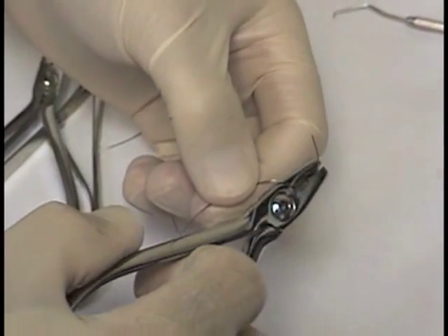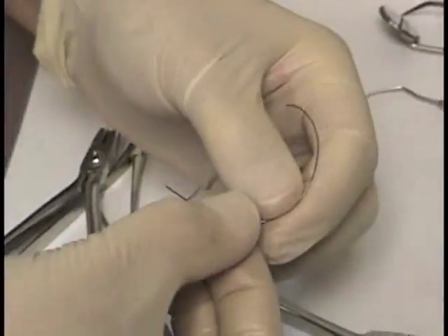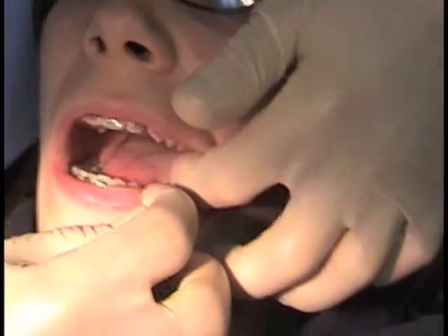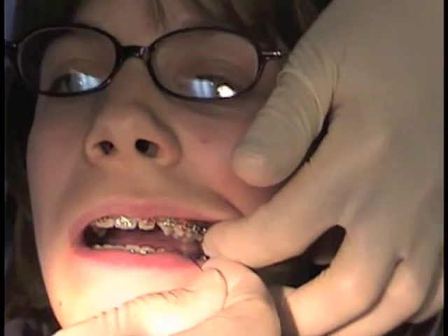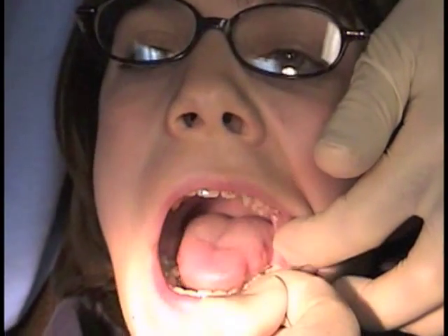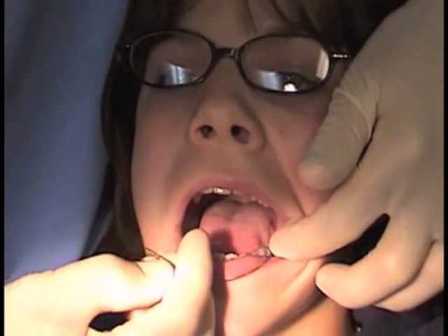So this wire is approximately curved — that's a moderate amount of curve and that's what we use for an 016 stainless steel arch wire. We'll put this in her mouth and just place it in, leaving a little bit sticking out.